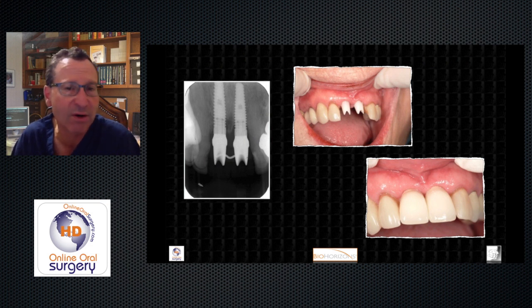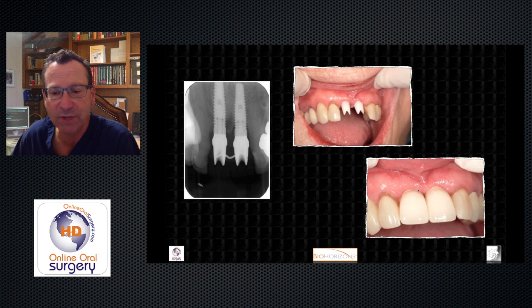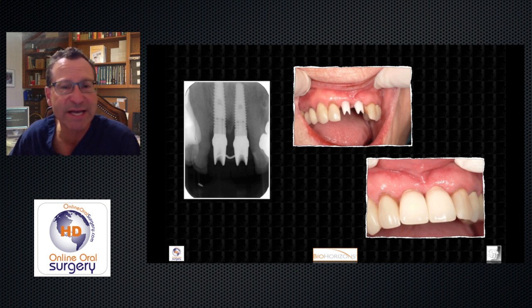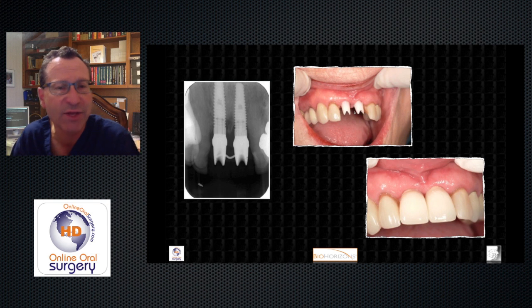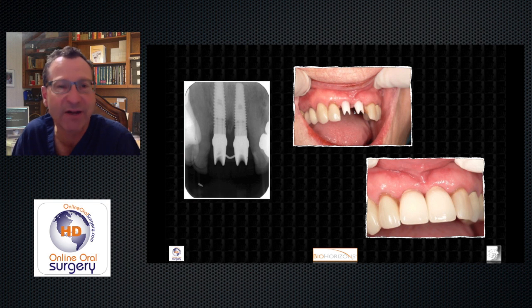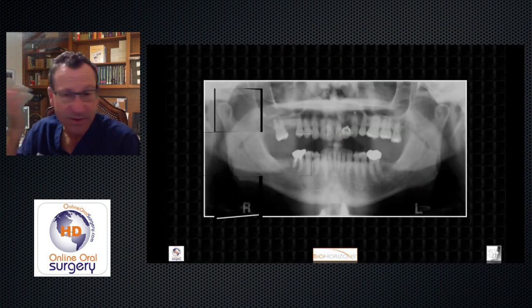At the second stage we placed our final abutments and provisional crowns, giving some time for the soft tissue to contour around these before the final restorations were made. We had nice positioning, nice aesthetics, good tissue margins — everything looks nice and healthy. We would call this a nice result of placing immediate implants. I didn't get final photos on this patient, but she had a very nice result according to the GP.